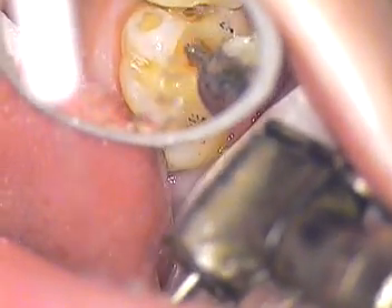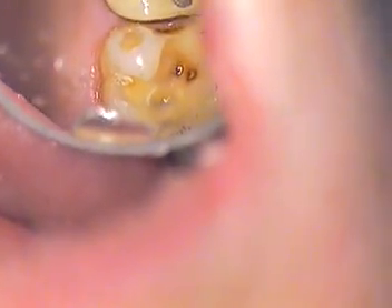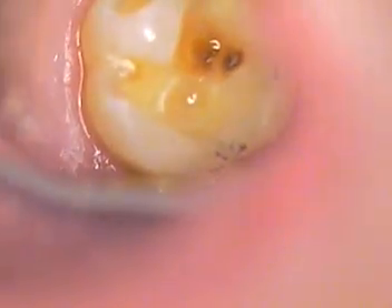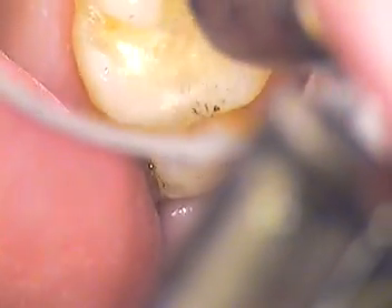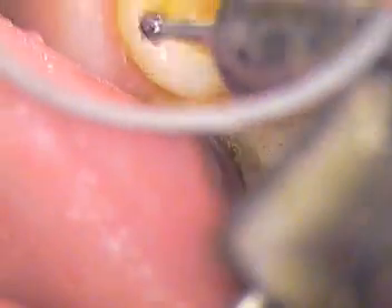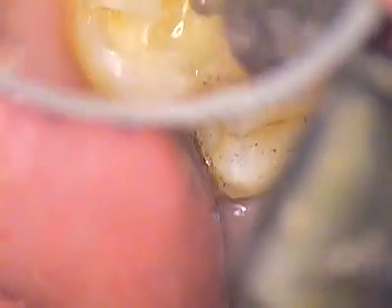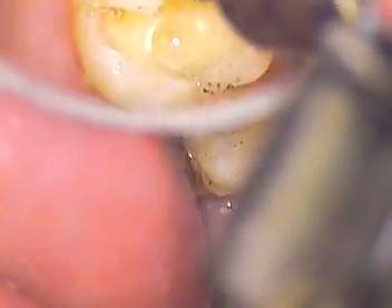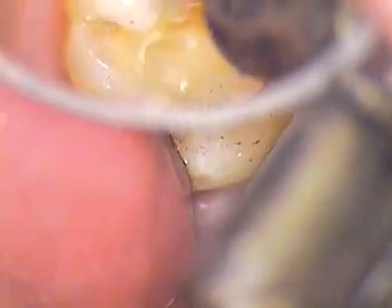I'm just going to touch base with Anna — are you okay? Everything good? She's good. I'm using a number 6 round burr, and we're just gently going in.